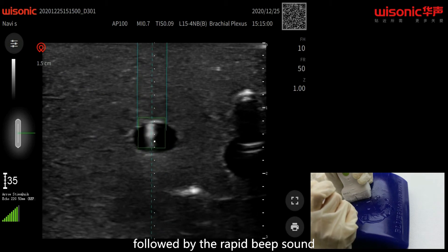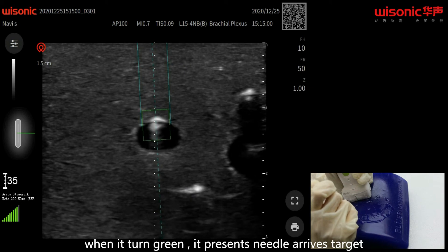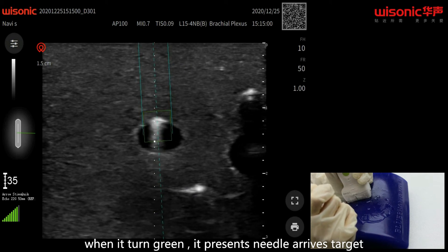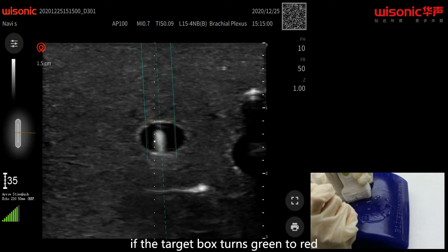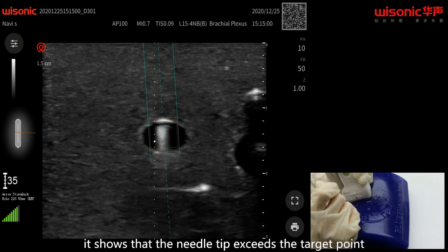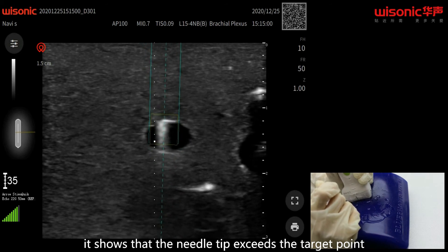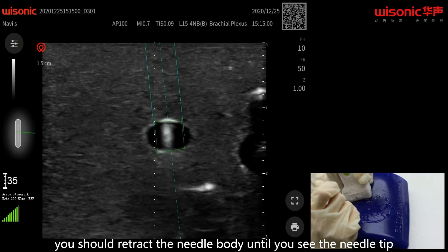Followed by a rapid beep sound, when the target box turns green, it represents the needle arriving at the target. If the target box turns from green to red, it shows that the needle tip has exceeded the target point.